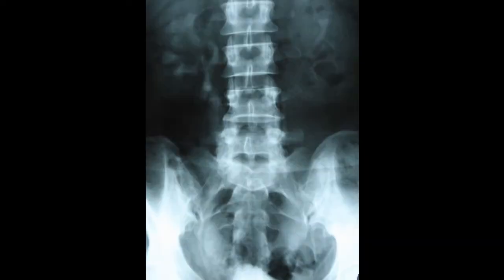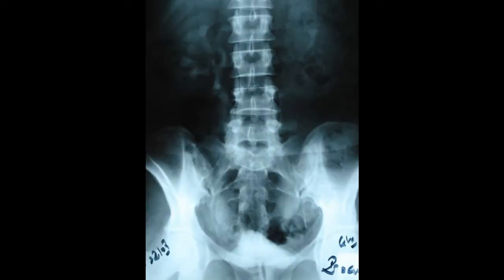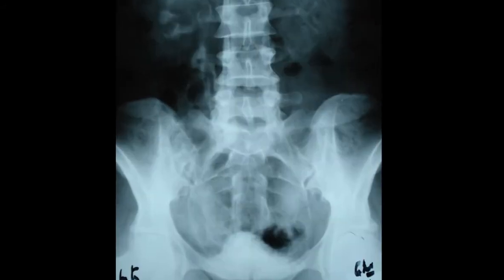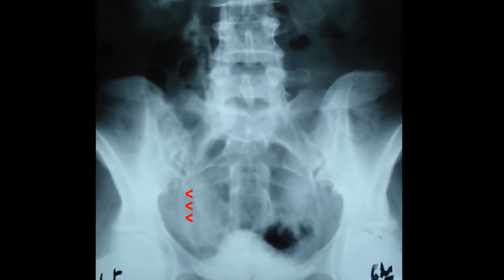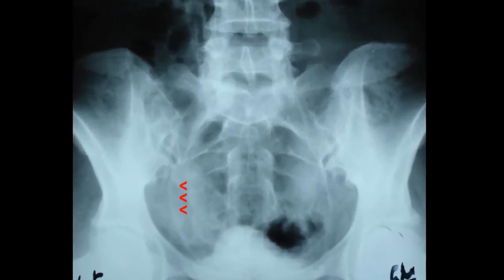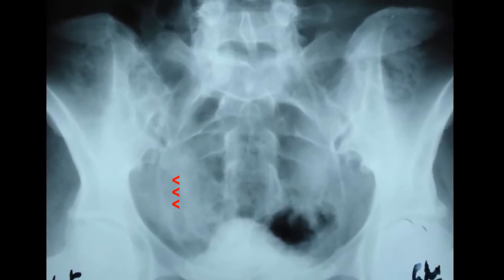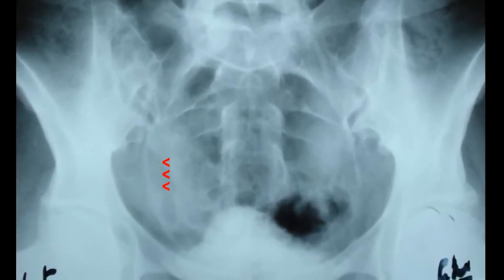Intravenous urography showing a non-dilated kidney and a normal diameter ureter.